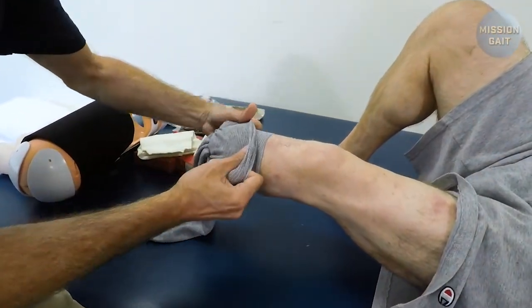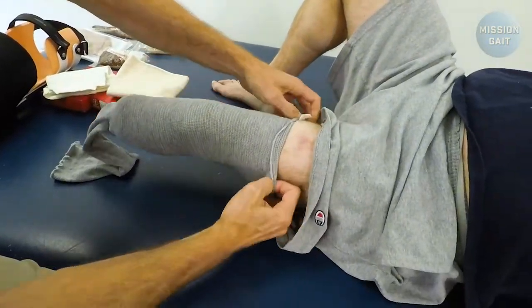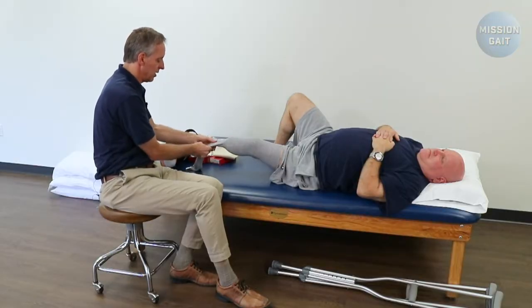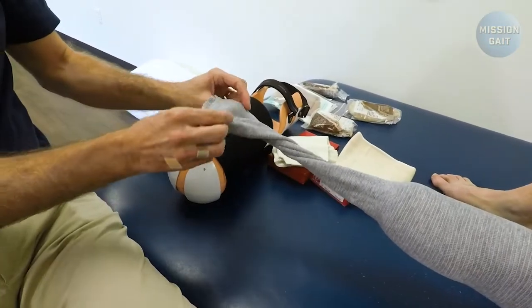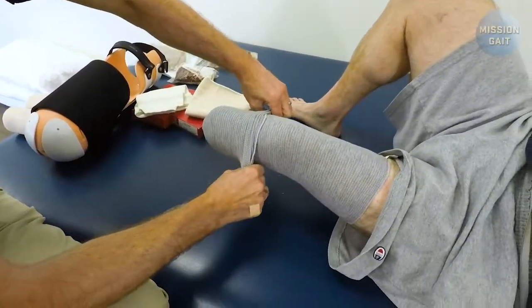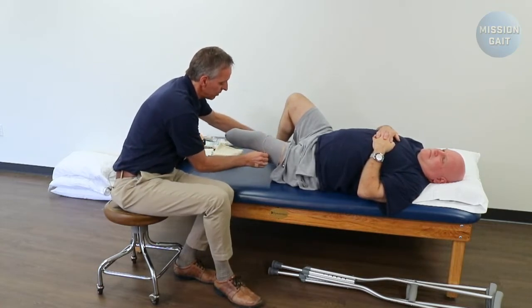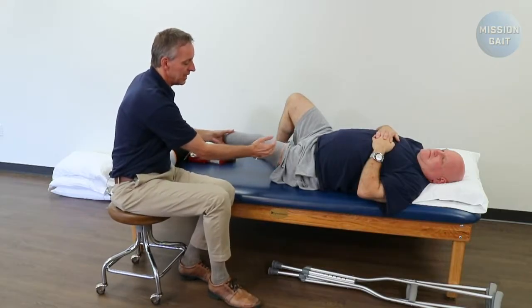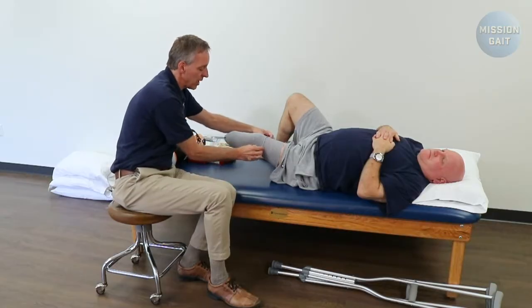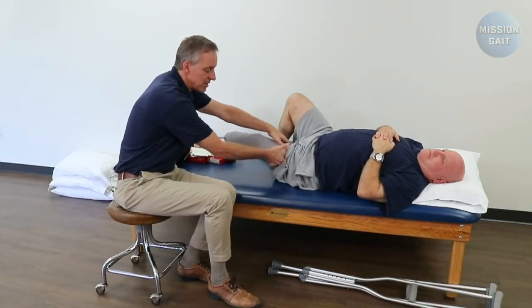From that point, bring the Compressy Grip up and over itself and right up the thigh. Roll it all the way out — don't leave any wrinkles or rolled-up spots, as that'll create a tissue dam which will hold fluid in place. Many of these Compressy Grips come with a ring; if so, just fold it back over. If yours does not have a ring, do a full turn in the Compressy Grip and pull it right over the end. Stretch it a bit wider and slowly bring pressure up onto the bottom of the residual limb — not super tight, but no gap either. This creates a gradient pressure pushing fluid back towards the heart. If someone needs more compression, bring the second layer back down, creating a third layer with more compression where needed and less pressure as fluid moves up the limb.